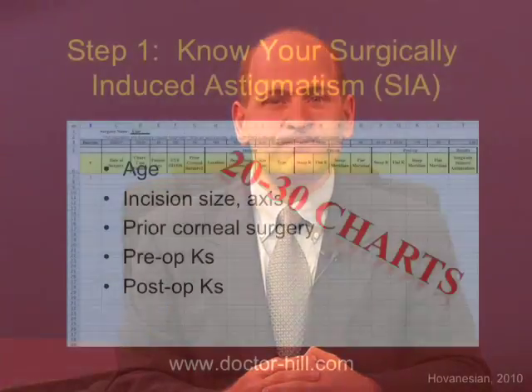The first step in doing LRIs is to know the effect of your corneal incision, your so-called surgically induced astigmatism, or SIA. For most surgeons who use a temporal clear corneal approach, the incision causes about a half a diopter of flattening at the axis of the incision.